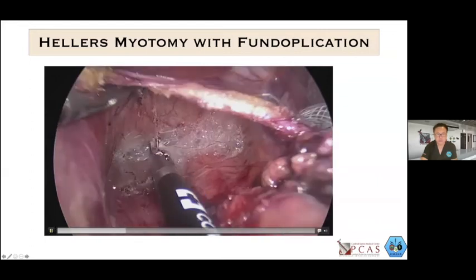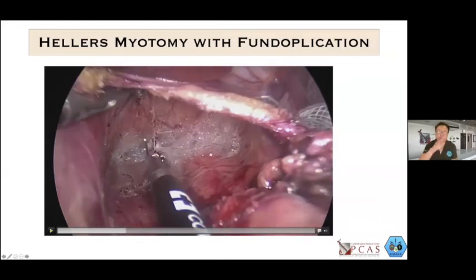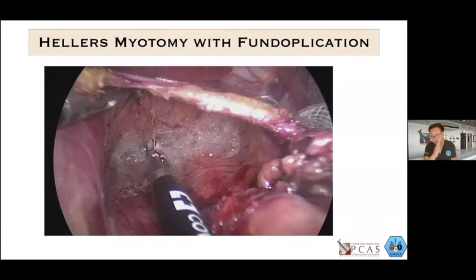So if you can take note of, even though you're deep inside your hiatus, because of the placement of that trocar, the first optical trocar, a little bit on the left side, when you put your telescope forward through that, looking through your hiatus, you're actually looking straight. Obviously, we're using a 30-degree telescope or even a 45-degree telescope.